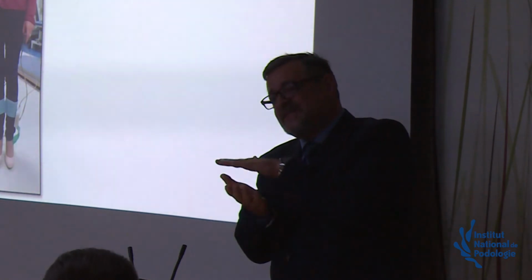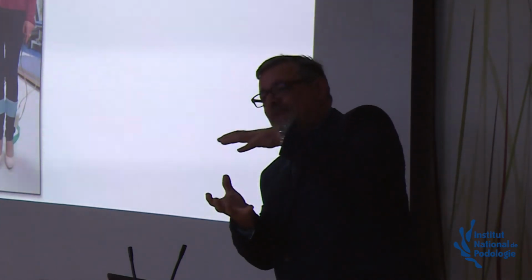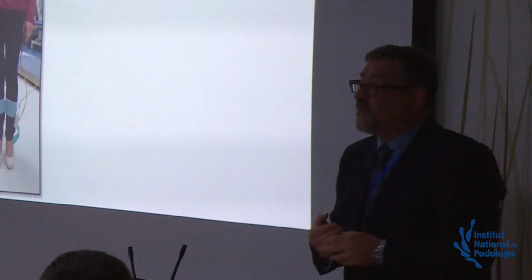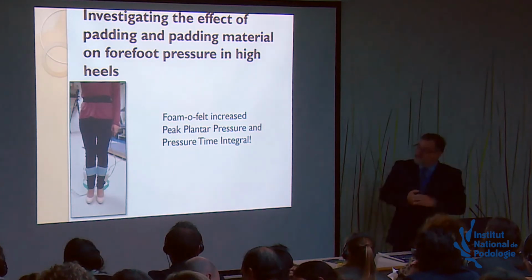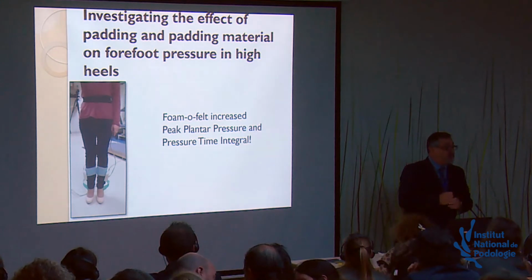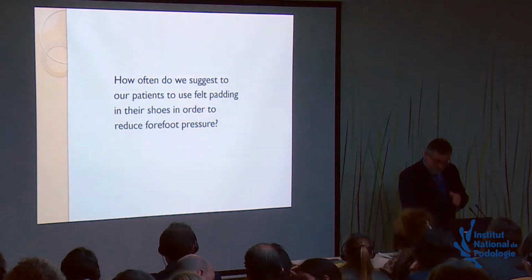So we are using this material because we are hoping that when we press on it, it does not get thinner, but it actually gets thicker. And it has very promising results. In this population, we had a reduction in pressure using this material, while with felt, we had an increase in foot pressure.